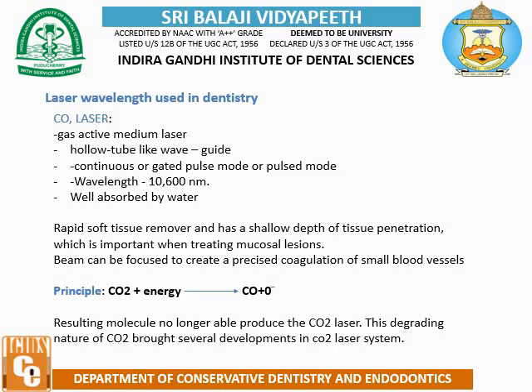Principle: CO2 plus energy gives CO plus O, the resulting molecules no longer able to produce the CO2 laser. This degrading nature of CO2 brought several developments in CO2 lasers.